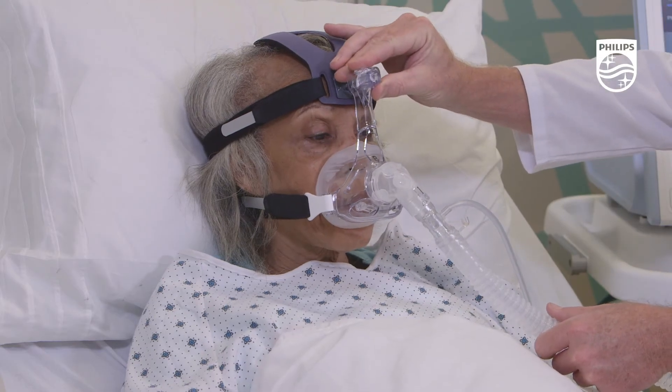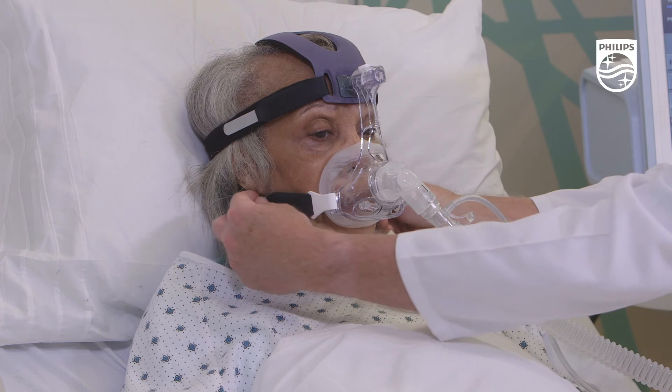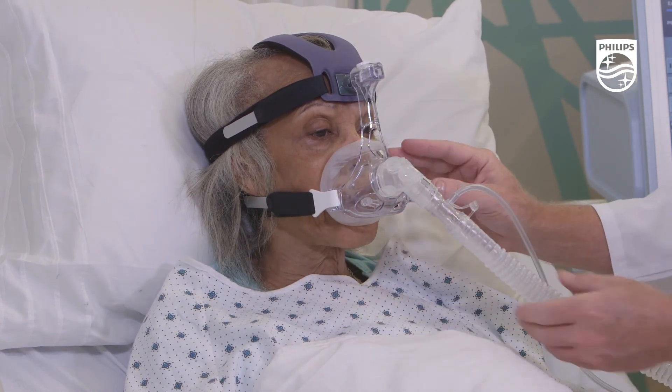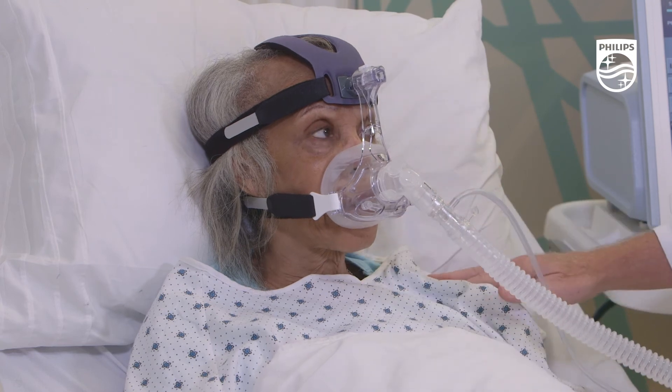Tightening of the upper head strap will not address leakage around the cushion, so be sure to manage this by adjusting the frame slider, ball and socket adjuster and lower strap tension.